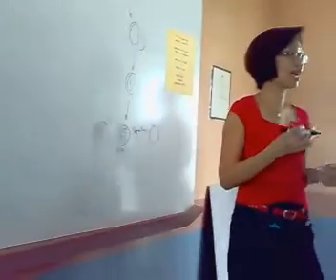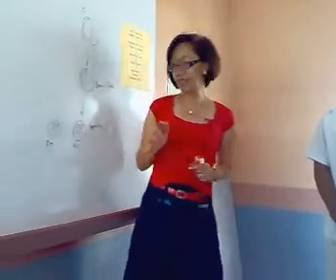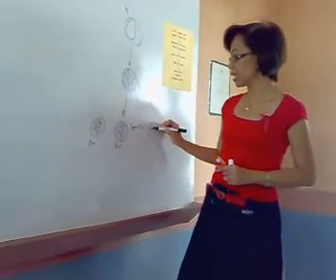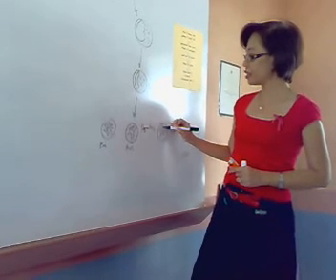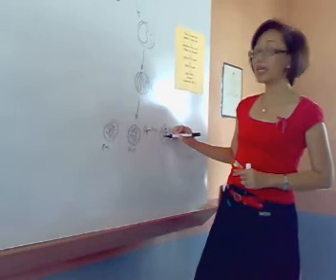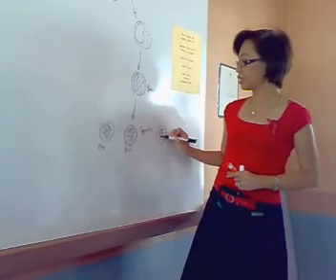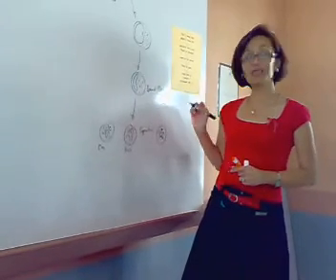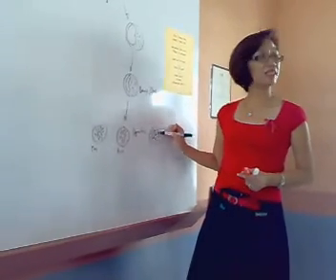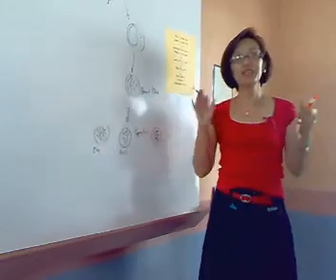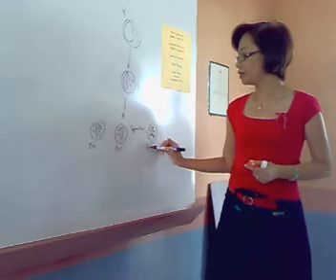As I said, it's very difficult to capture basophils because the granules usually wash out with the staining. Sometimes you can also have the granules obscure the nucleus there. But the granules are very, very big. They wash up with staining, but they're very, very big. And if you're lucky enough to see a really honest-to-goodness basophil, then the granules practically fill the whole thing, and you may not even be able to see the segmenters. These are the basophils.